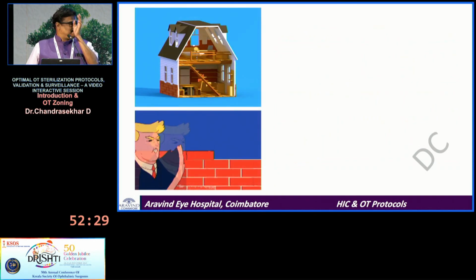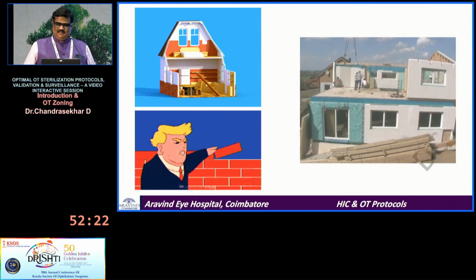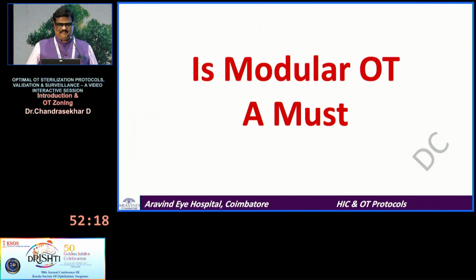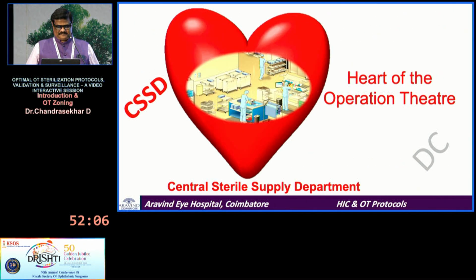So what are we seeing here? We are seeing a manually constructed OT versus a modular OT. Modular OT has many advantages, but it is not mandatory. It is not at all mandatory. A regular OT is as good as a modular OT, but a modular OT can be customized, maintained, and it is a long-term prospect for any hospital.